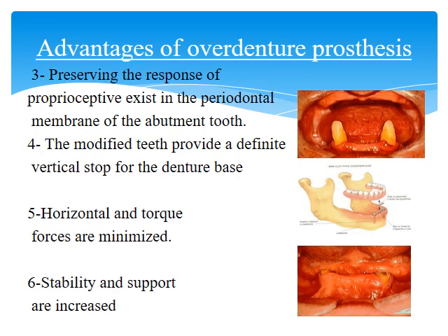Fourth, the modified teeth provide a definite vertical stop for the denture base. Fifth, horizontal and torque force are minimized. Sixth, stability and support are increased.